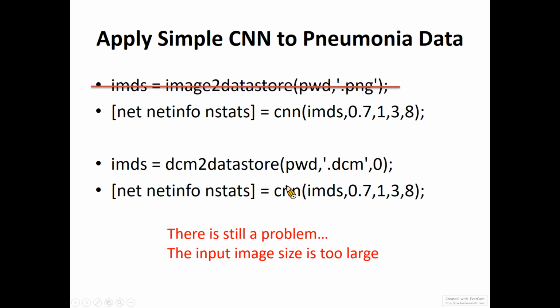So you might be wondering that as humans, we want to see every detail of the chest X-ray images. Then if we just resize our images, is it possible we could lose some detail about the chest X-ray images? I think that is true, but remember that the computer works on pixels as very small-scale data, so it doesn't need very detailed image data to see the features.